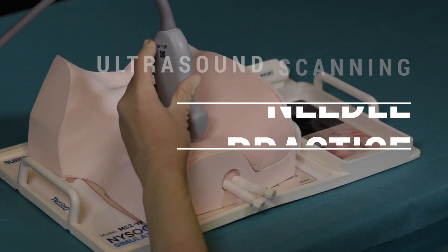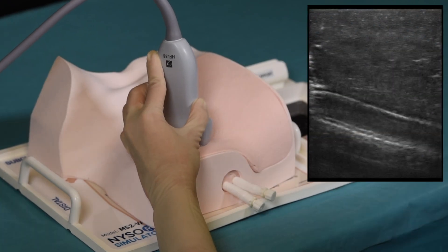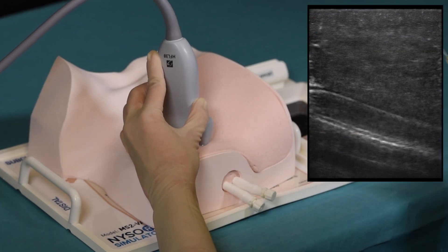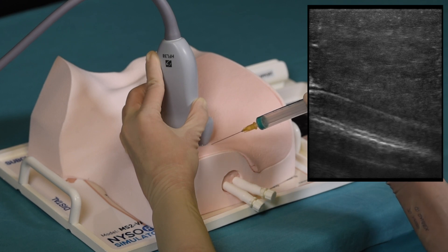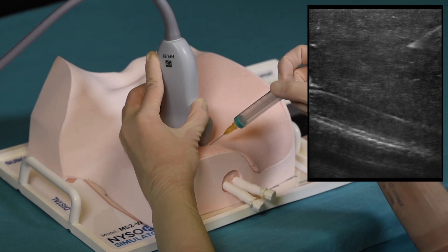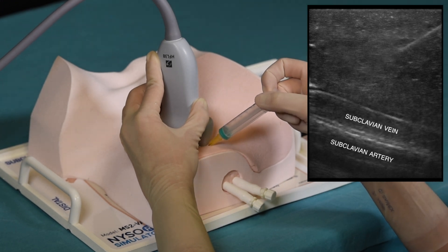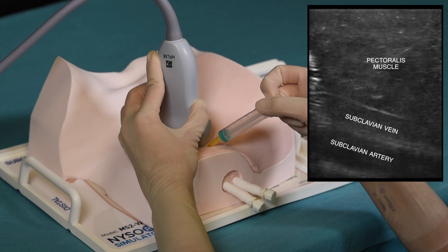To begin practicing, apply a generous amount of gel on the surface of the simulator before sonographing. It is important to increase the ultrasound gain because of the difference in the simulator material and real human tissue. In this particular example we see the actual image obtained by the NYSORA simulator — the subclavian vein on the top and subclavian artery on the bottom.